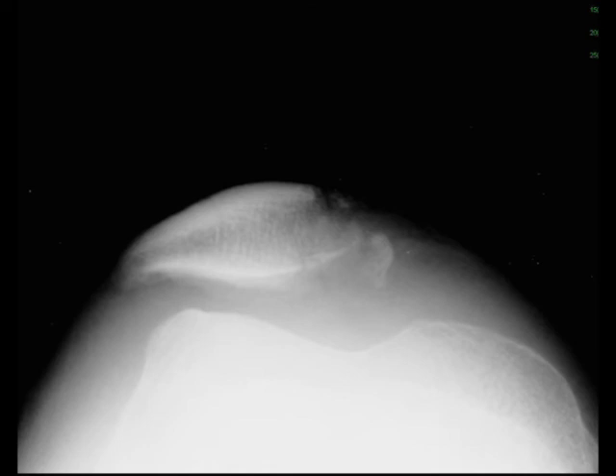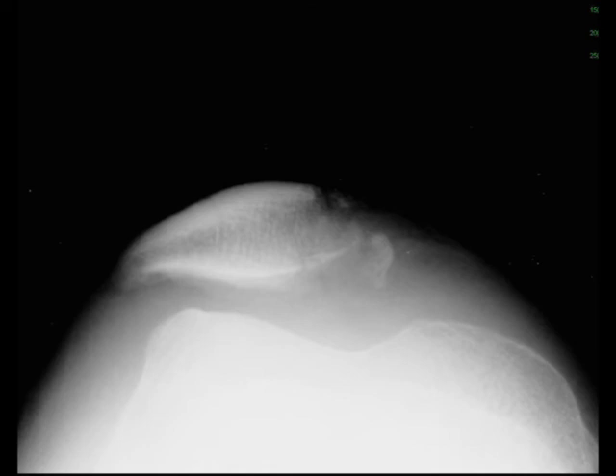But on the sunrise view of the patella, you can nicely see that there's a comminuted fracture of the patella. The sunrise view is often used if you're thinking there's injury to the patella, because it's really a focused view of the patella.